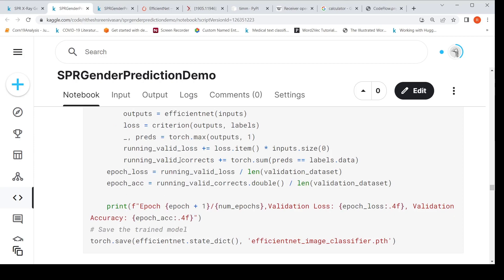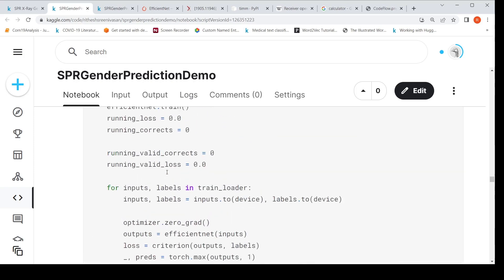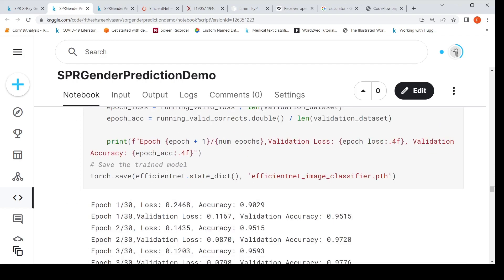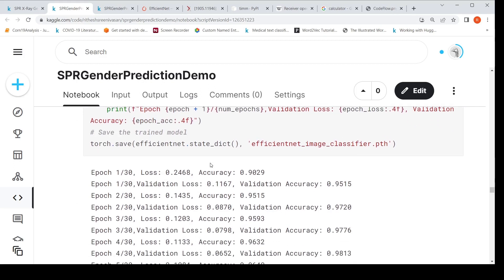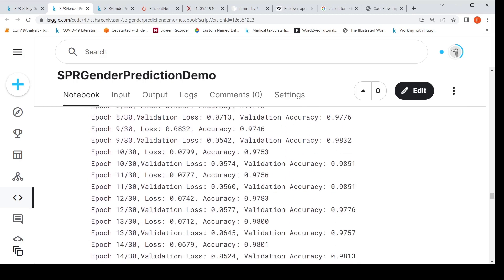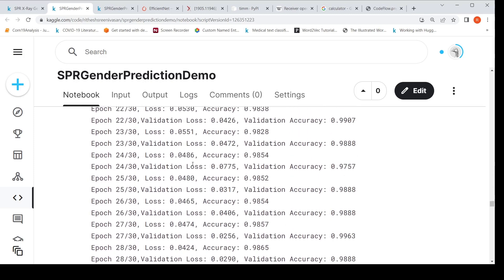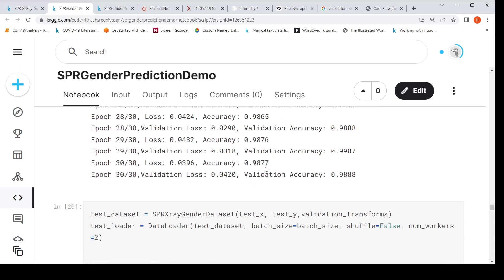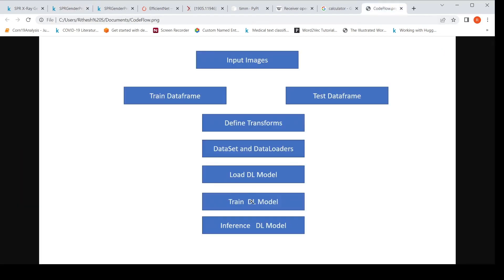An epoch is one full iteration over all the batches of training data. Once we have trained each epoch, we also evaluate the model on the validation data and compute the validation accuracy and loss. We do this for 30 epochs, and then we save the model to a particular path. After 30 epochs, the model has an accuracy of 98% on the training data and 98.8% accuracy on the validation data. So in this way, we have trained our model.